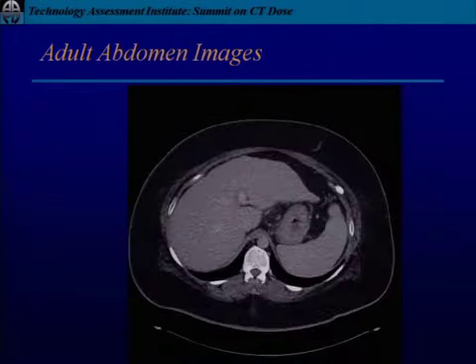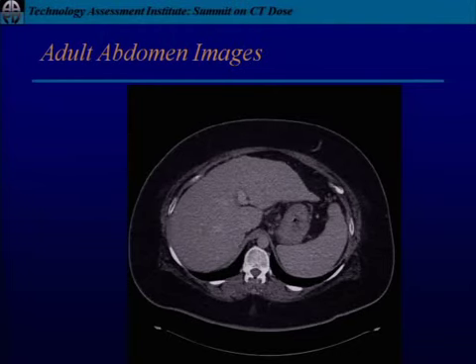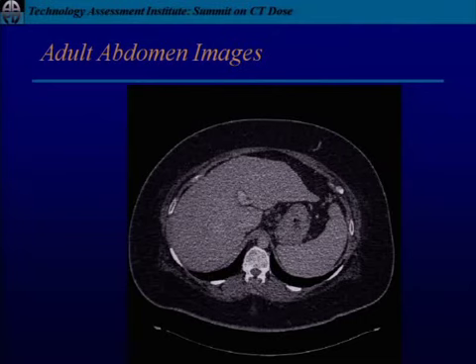Now we're going to look at it a slightly different way. Now I'm going to show them not next to each other, but one at a time. So here comes the 5. Pick an area, just like Jim asked you to. Pick an area that you were looking at. I was looking right around here. And I'm going to change it to the 3, and now to the 1. You appreciate that difference?